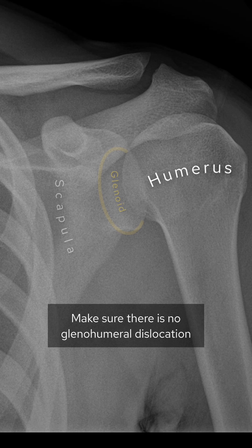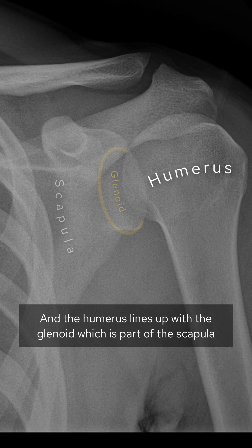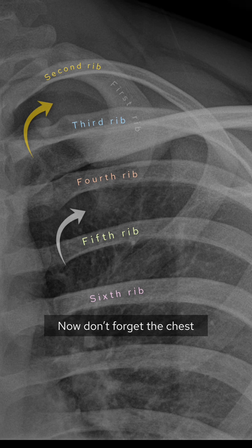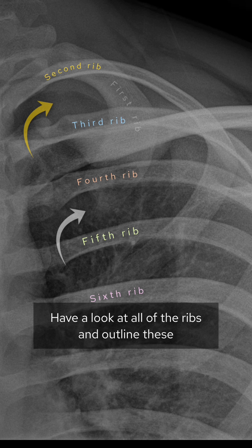Make sure there's no glenohumeral dislocation — the humerus should line up with the glenoid, which is part of the scapula, and that's okay here as well. Now don't forget the chest: have a look at all of the ribs and outline these.